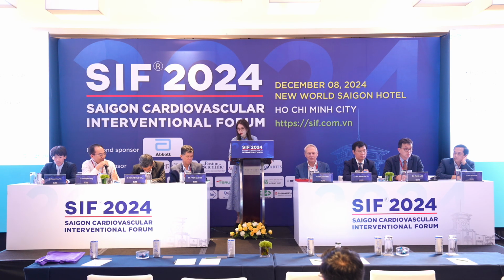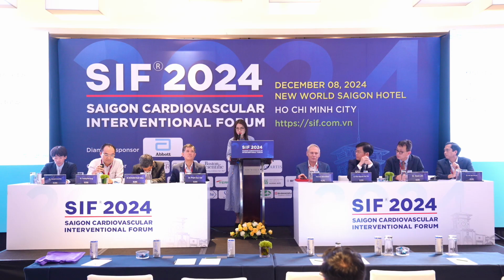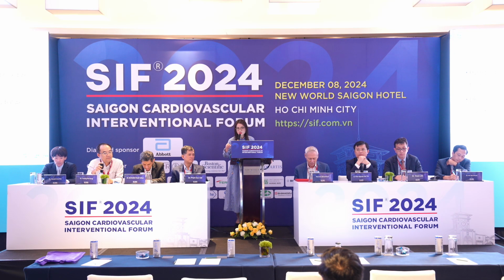Thanks for your question. It is a very important question for us when we do PCI in a high-risk patient with a complex lesion and a very low cardiac function. So in my practice, when I do this, I never use ECMO. ECMO just supports hemodynamics for patients with a high dose of inotrope. So for this patient, if we want to support hemodynamics, I just use IABP.